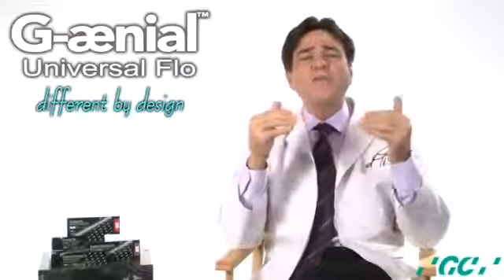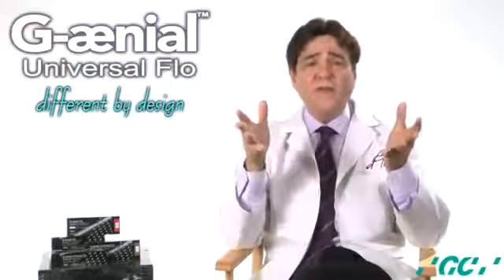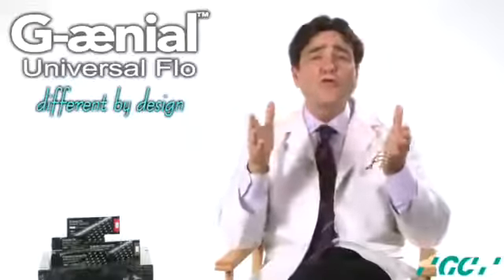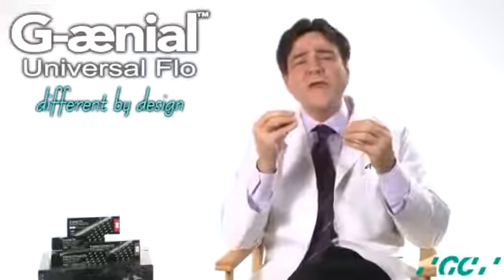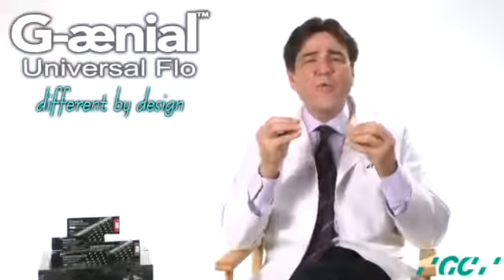In view of all of these considerations, it is understandable that clinicians have uncertainties about selection of biomaterials and techniques to optimize the material's properties and to achieve predictable long-term results. To improve this selection process, the restorative dentist must have a working knowledge of these consideration factors and integrate this knowledge with the proper technique for each clinical situation.